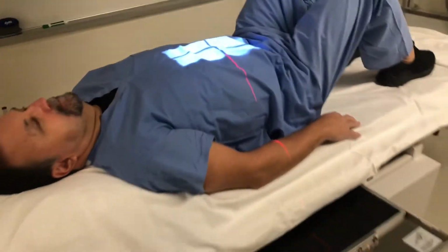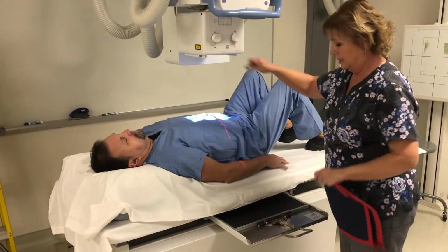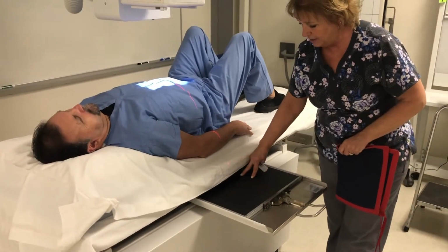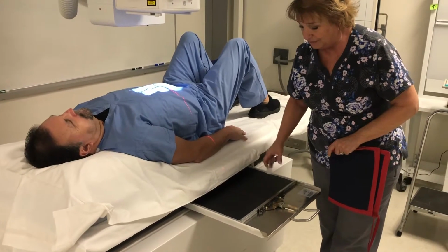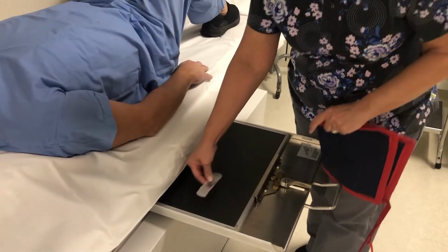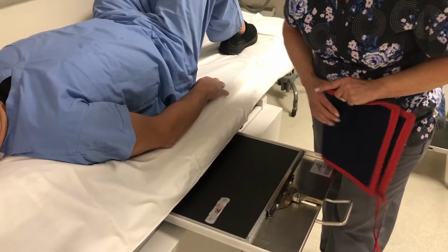Okay, add my right marker. Lumbar spine imaging is shielding per department protocol. And keep in mind, we've got our L spine coming down, and one of the things that we are also hoping to include is the SI joints. Because of that, if I place my marker at the bottom, I might have my marker end up in the SI joint. So for the lumbar spine AP, I'm going to put my marker at the top. I'll get the L spine and then the SI joints at the bottom.